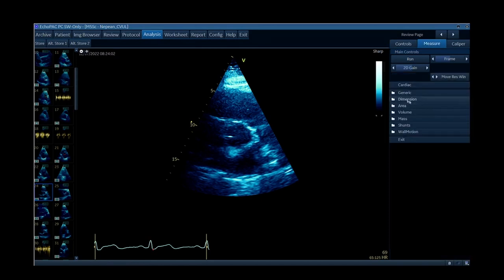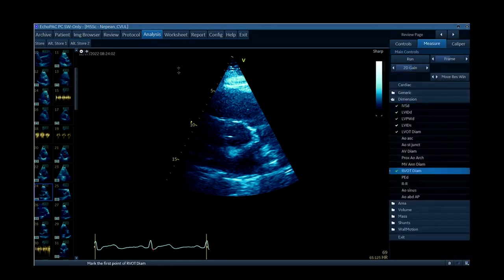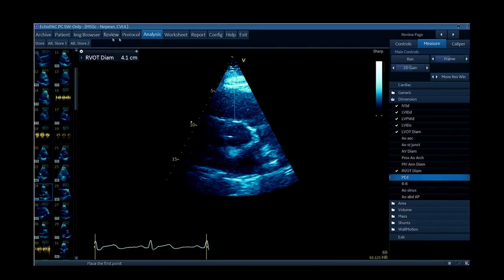We should mention the timing of measurements — end diastole. You can see here in the short axis, tilted just past the aortic valve, we're measuring the proximal RVOT. These are 2D linear measurements, inner edge to inner edge, at end diastole. The proximal RVOT diameter in this view — the upper end of normal per ASE guidance is 35 millimetres. The distal RVOT can be really difficult to obtain.